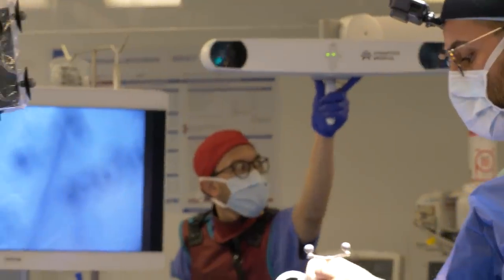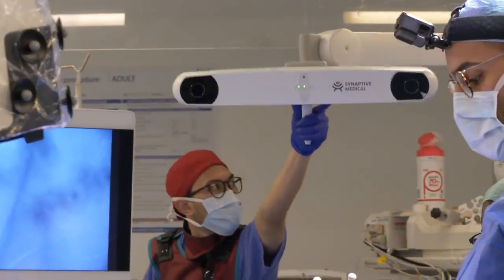This video we're going to show you real surgical footage of how we removed a bullet from a spinal cord. This video has graphic surgical footage so please do turn away if you are squeamish or under the age of 18.